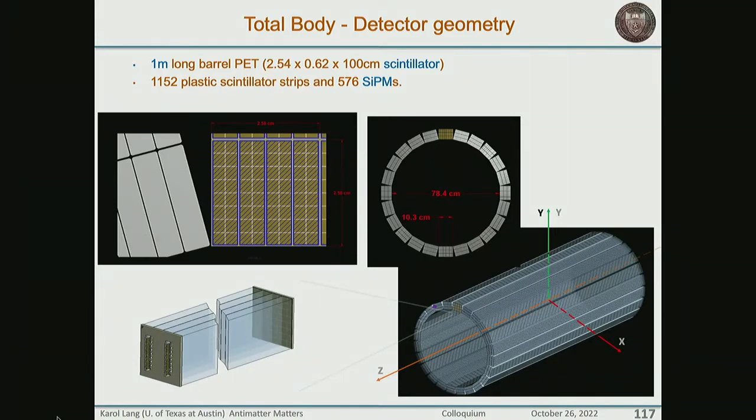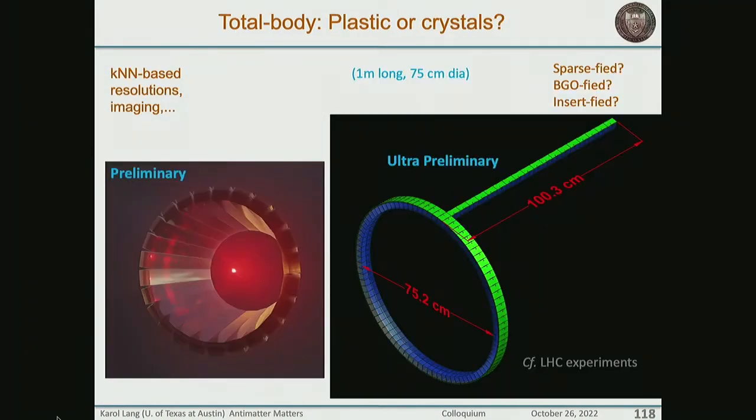One of our undergrads, who started working on it when he was in high school, worked with our group, and Akil did a fantastic simulation work on it. In fact, he employed a machine learning algorithm, one of the algorithms that we used in one of the neutrino experiments. This is his rendering of a plastic scanner, about a meter long, exactly a meter long, with a source in the middle. And you see that he can reconstruct that.